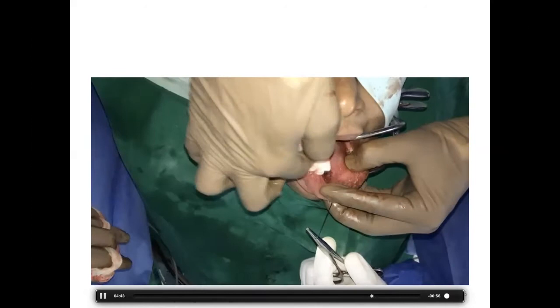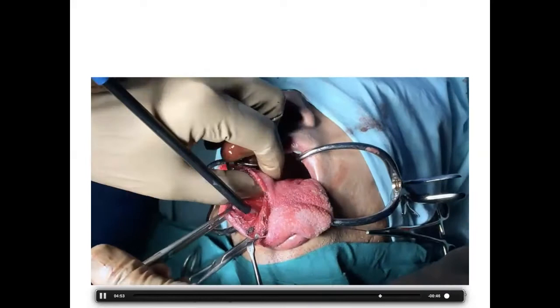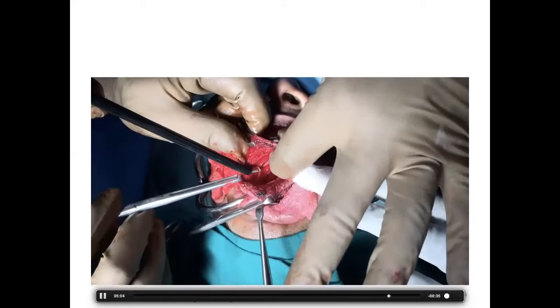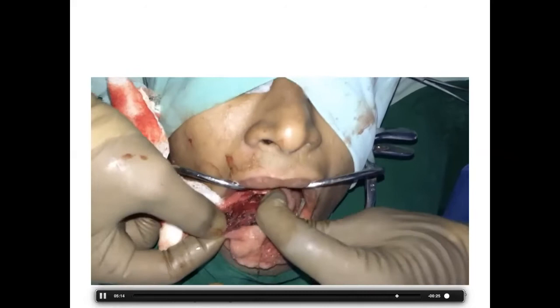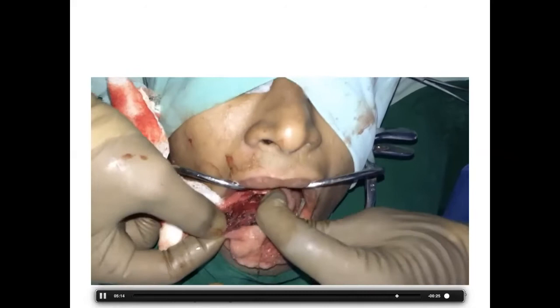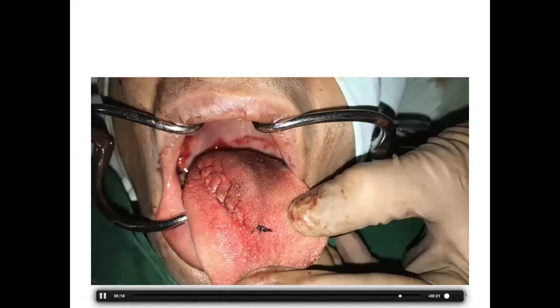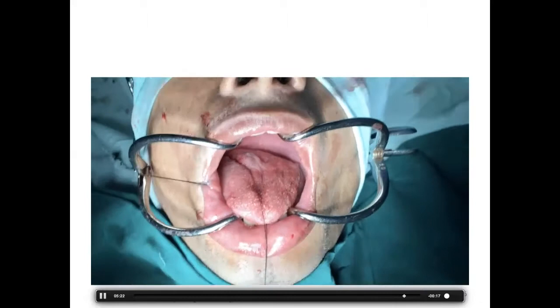The most important use of the coblator here was achieving complete hemostasis from the profunda lingual artery — a branch of the lingual artery — using coagulation mode. The advantage over bipolar was that because the hypoglossal nerve is in close proximity, the coblator's coagulation transmits far less heat energy. At the end of excision the airway was opened up — a near-bloodless field. It came out as a schwannoma.